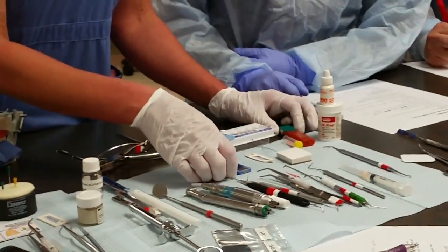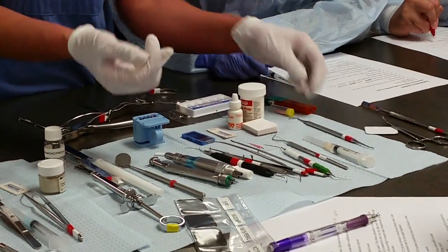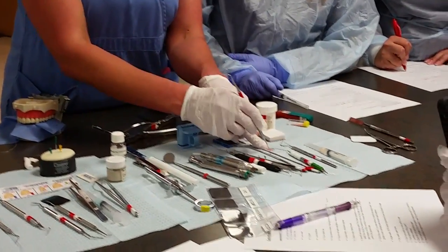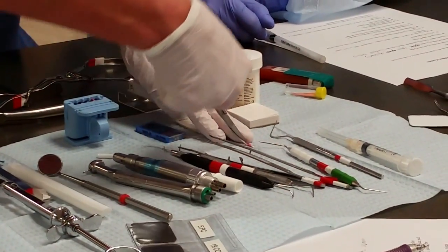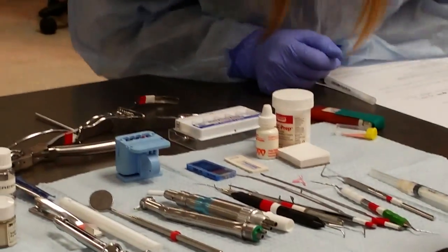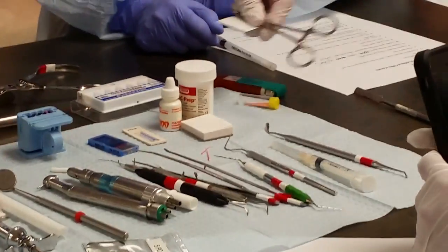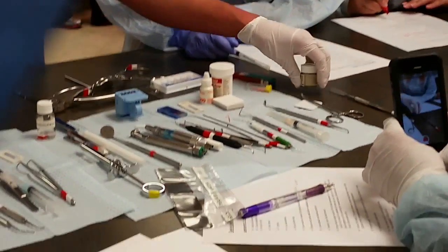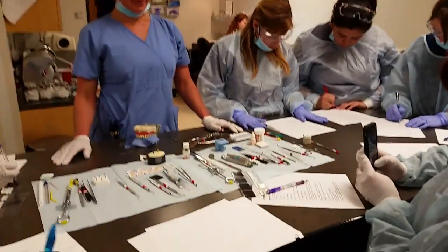Once the gutta percha is placed and sealed into the tooth, we cut off the excess gutta percha sticking out from the top. We use the Glick instrument, heat it up until it's nice and hot, and since the gutta percha is a plastic material, it easily melts so we can cut off the tops. Excess material goes into the HVE. Then we take a final x-ray to make sure we've reached down to the apex. Finally, we place a temporary material — either IRM or Cavit — and the patient is referred back to their regular dentist.